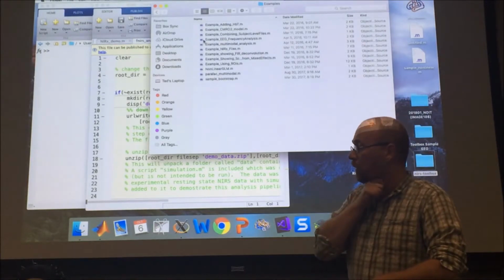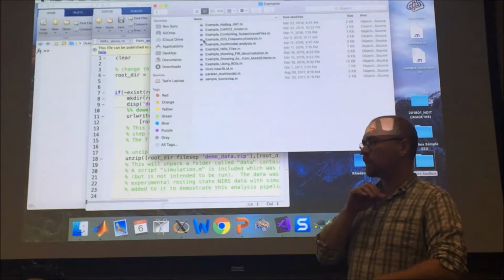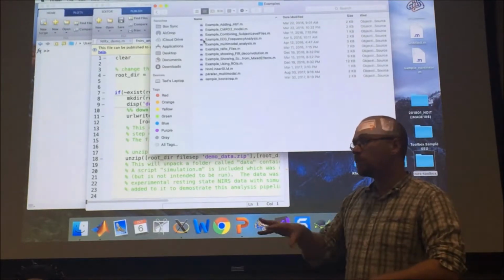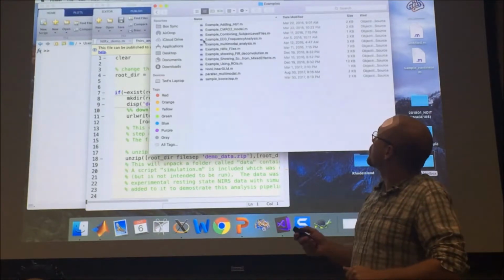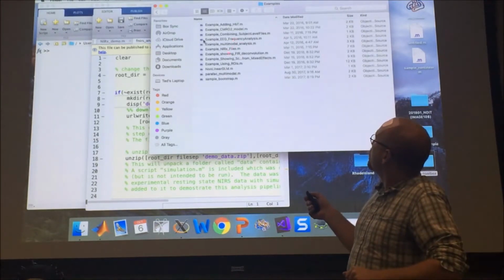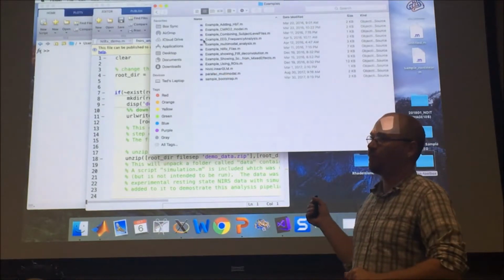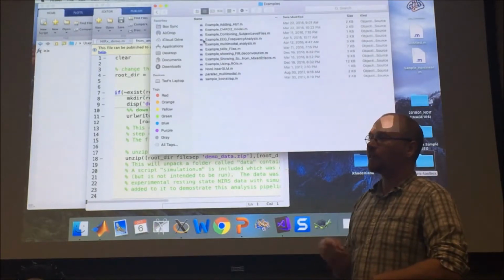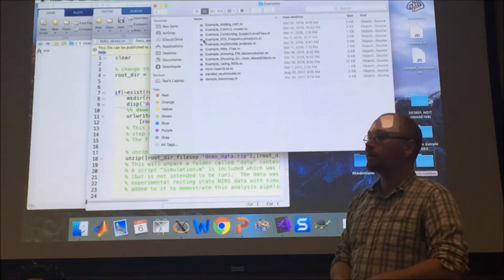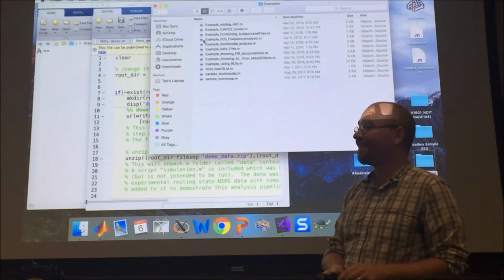Is this multimodal? At this point it's single modality, like NIRS imaging. We've started to look at multimodal analysis, or this Parafac multimodal approach, which is way more advanced than I want to talk about here, and that gets into the ideas of multimodal connectivity. But you can look at what we've been doing here.